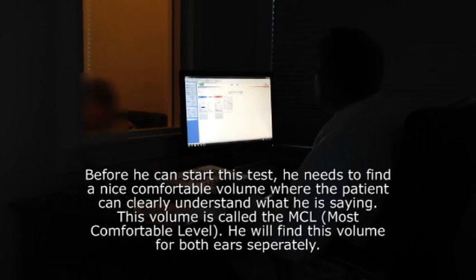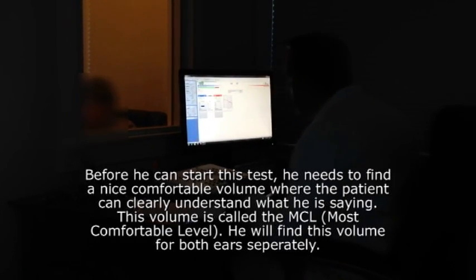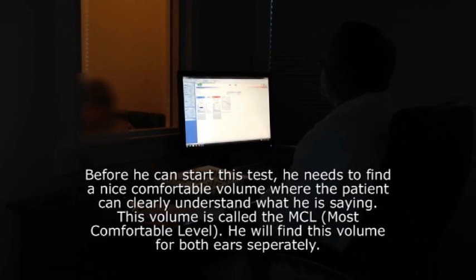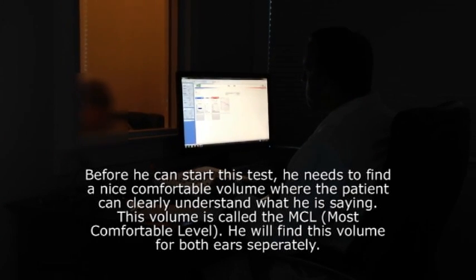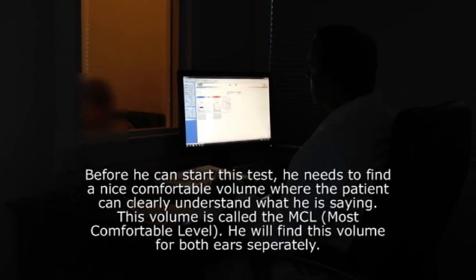Okay, Leah, I should just be in your left ear now. Is that a comfortable level right there? Okay. If I was a television, would you turn me up, down, or leave me about the same? Okay. If I went up to here, is that getting a little bit too loud?